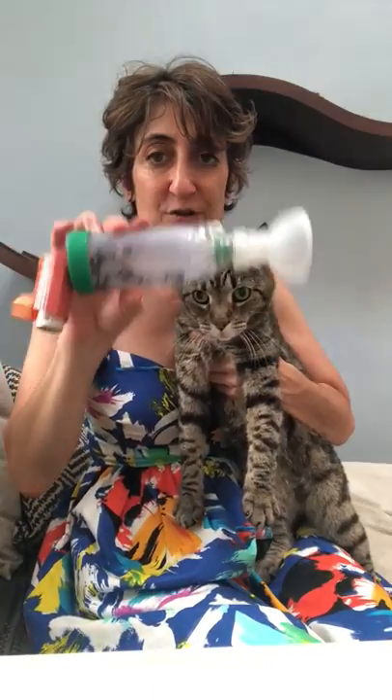Hey guys, sorry I don't look so cute, it's a little hot, but I wanted to do a quick video on giving your cat an inhaler, which is something I've been having to do with Kippy here for a while. So let me first show you a few things.